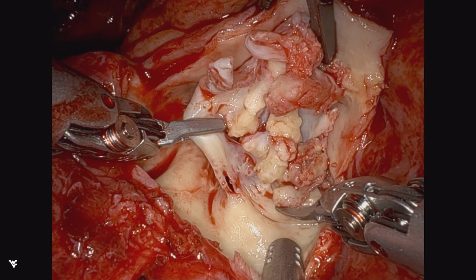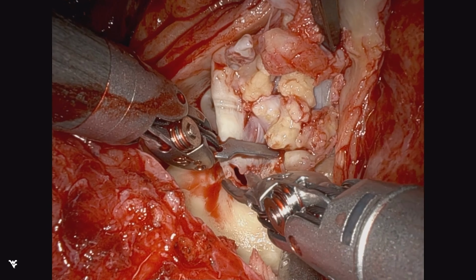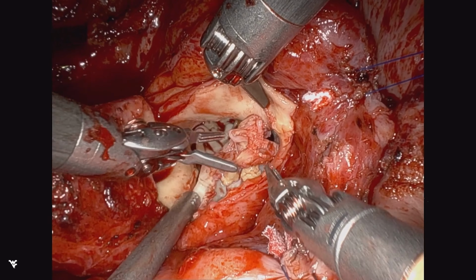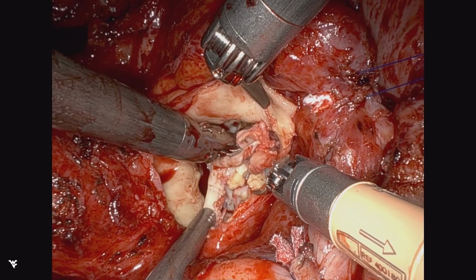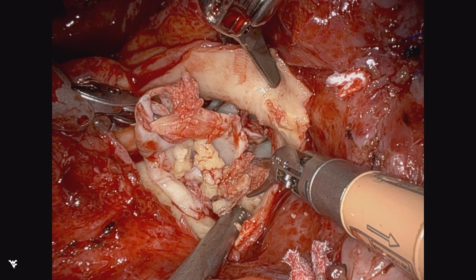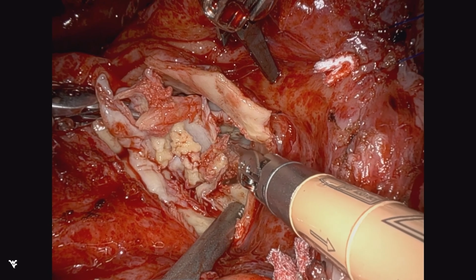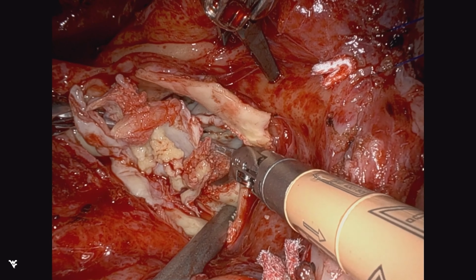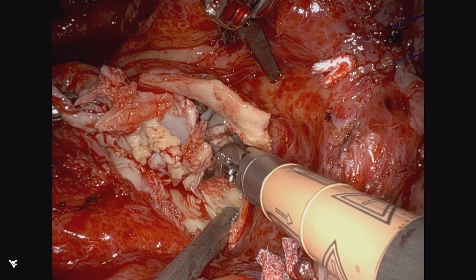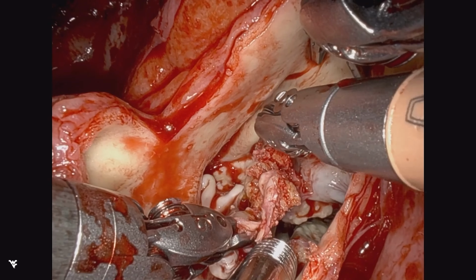So we have to be very focused and remove any and all particulate matter, but also, more importantly, attempt to navigate this more penetrating calcific disease. As many of my surgical colleagues have been in this situation, these can be challenging cases, but at the same time quite enjoyable and satisfying when we can get an excellent debridement.